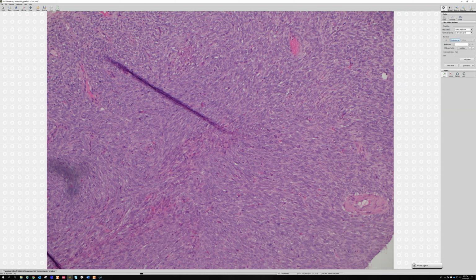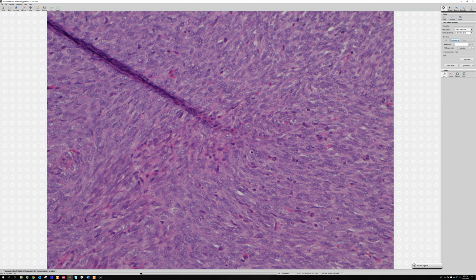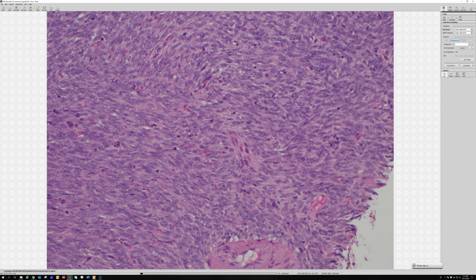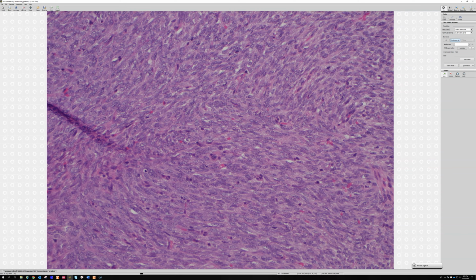That's a pretty classic area right there, that streaming, plump spindle cells and the uniform nature of them, how they don't really have any pleomorphism. That's really key. That's a very characteristic, helpful finding. What immunostains, aside from the SS18, SSX, what immunostain profile would you expect for synovial sarcoma? I think the keratin, EMA positive, TLE1. Excellent.